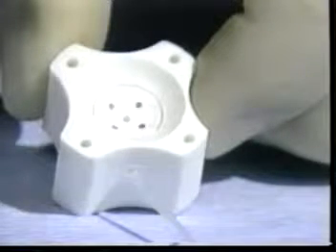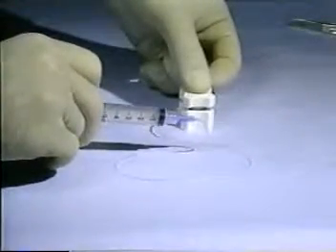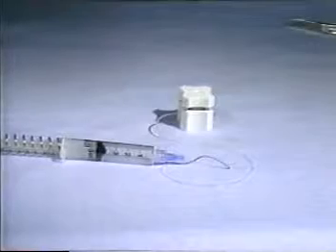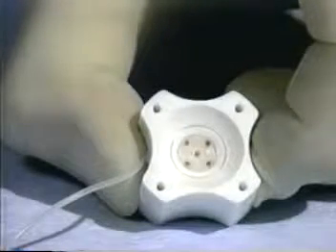The well of the cutting block also contains a circular trough 12 millimeters in diameter. The syringe creates a vacuum behind the holes and trough in the well of the block. This prevents the cornea from slipping as it is being cut and ensures the corneal button will remain in the well of the block and not in the blade when the blade is removed.